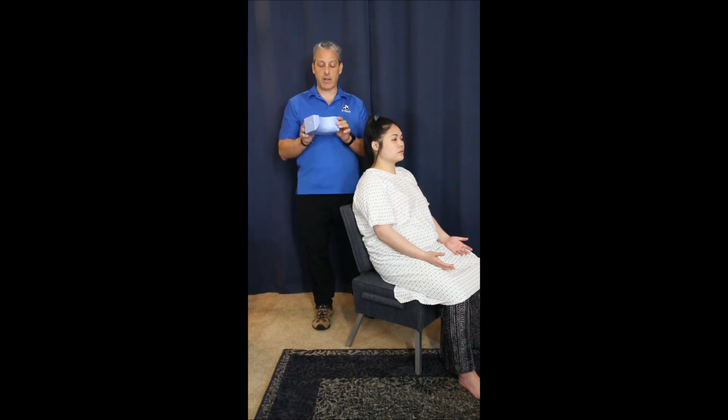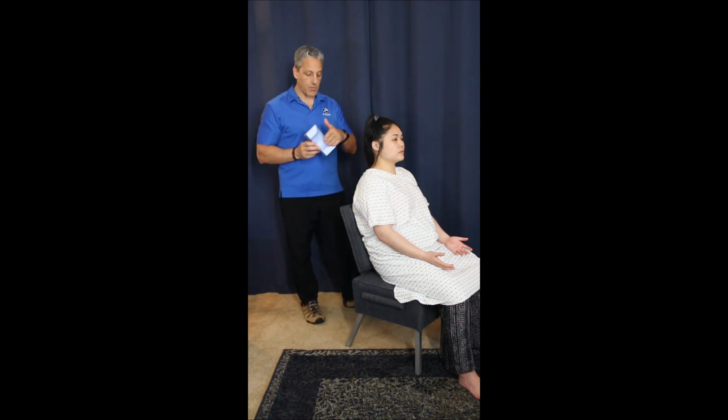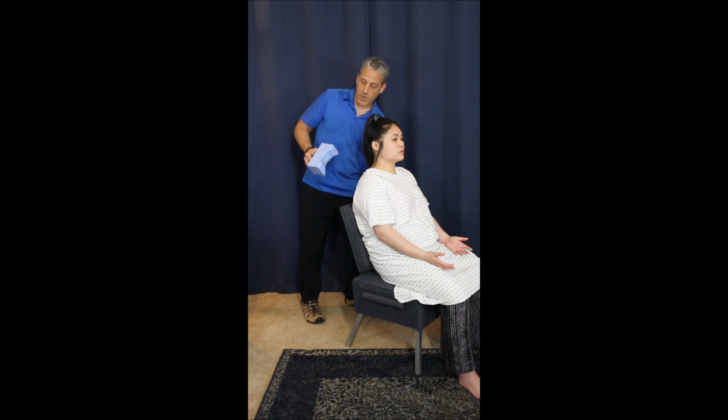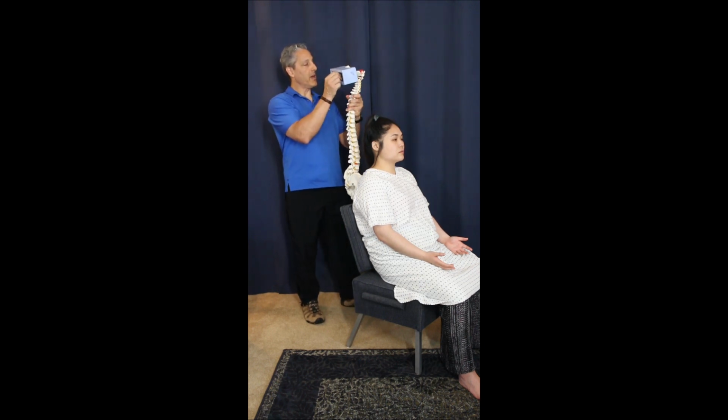The block does have a top side and a bottom side. The top side is the square side here. The bottom side is the rounded side. It has a rounded edge and it has a little notch in it for the VP. So this rounded edge sits over the shoulders. What this block will do is we slide it down right off the occiput. Once we get to the bottom of the rim of the occiput, it slides right into the cervical spine and stabilizes the cervical spine for this adjustment. And I'll be doing the same positioning on the patient.